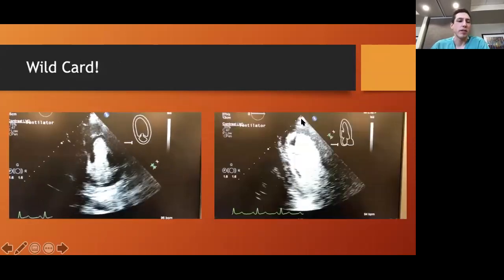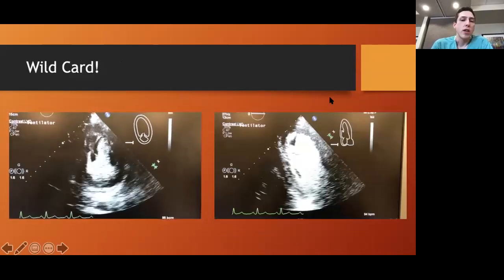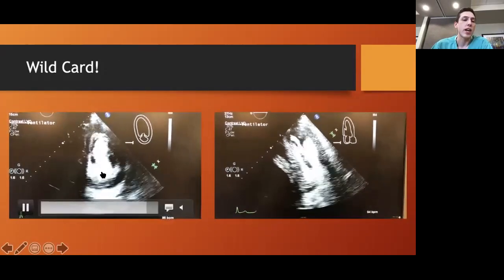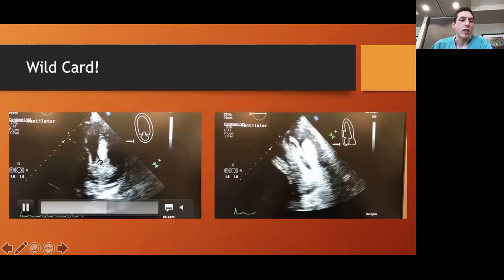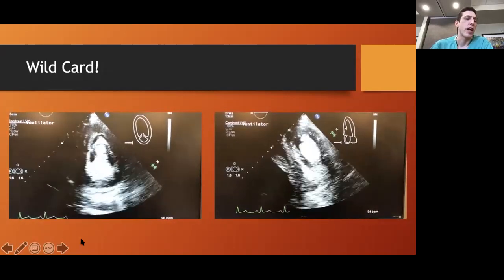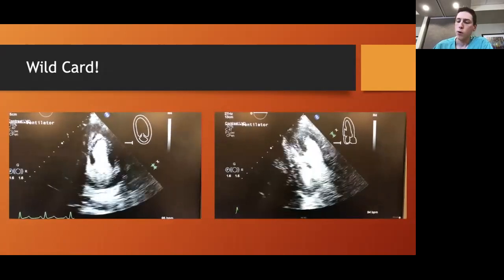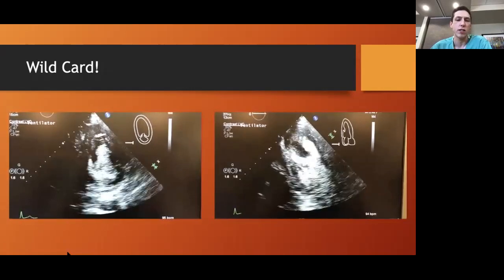Interestingly, this is a bit of an aside, but before starting inotropes, a cardiology-performed echo was obtained with Definity contrast. You can see here, the Definity contrast is this lipid emulsion that makes the LV cavity light up with this bright white color. It helps you visualize structures in the LV better and better assess the border of the left ventricular cavity, to better assess for wall motion abnormalities and LV function and ejection fraction estimates.